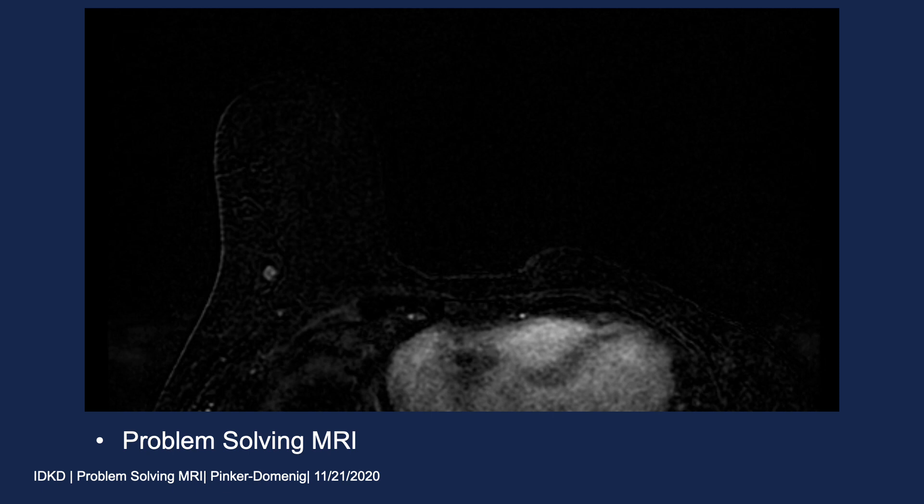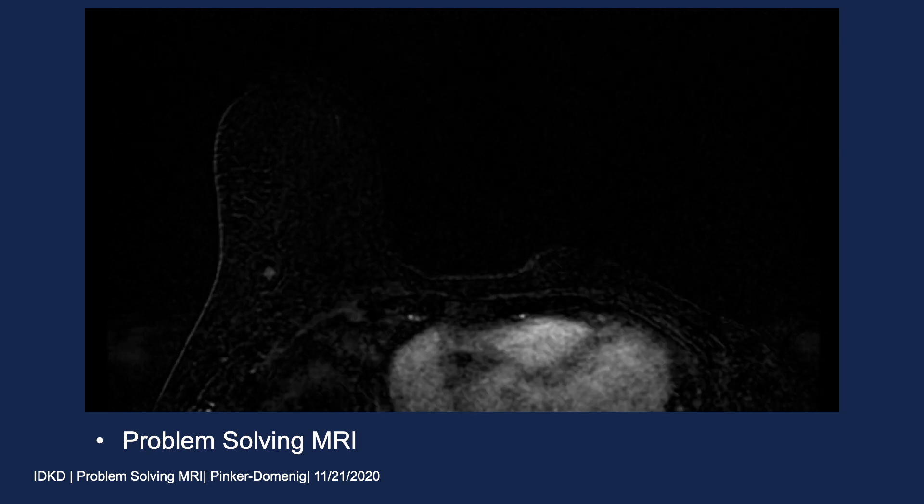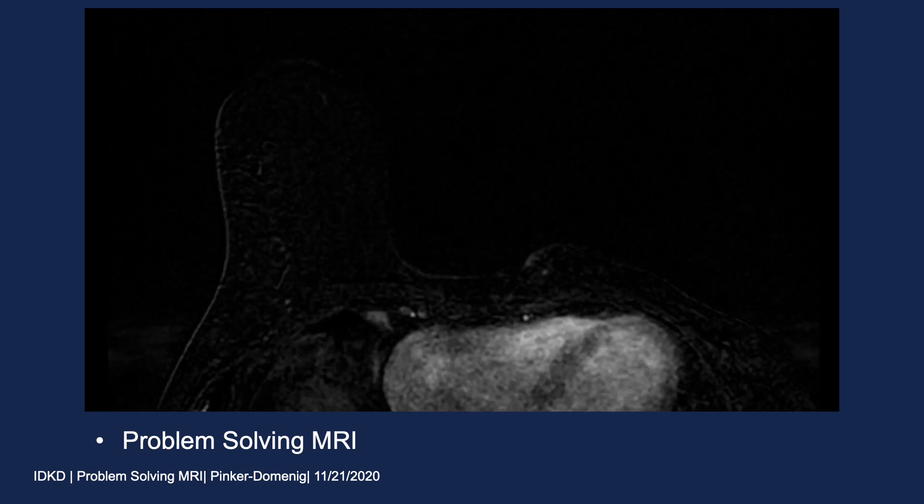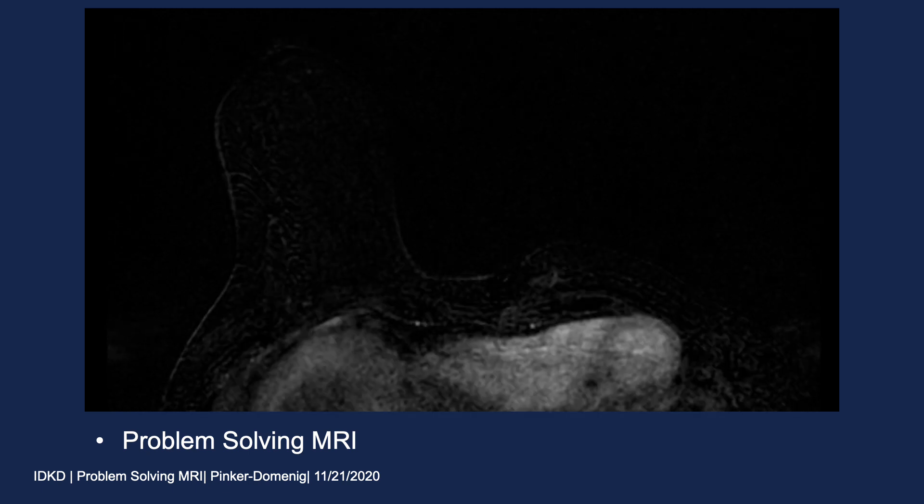Proteinaceous content will also be hyperintense on T1, but when there are no solid components it will not enhance. In particular, that area with the dilated duct retroareolar — we can see the nipple here — shows no enhancement at all, which is very reassuring for the patient.